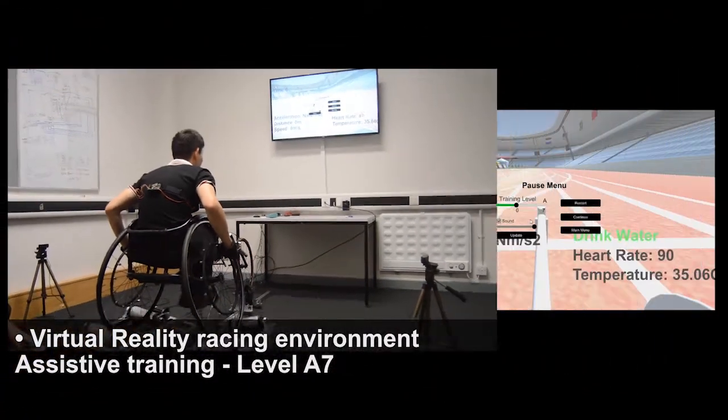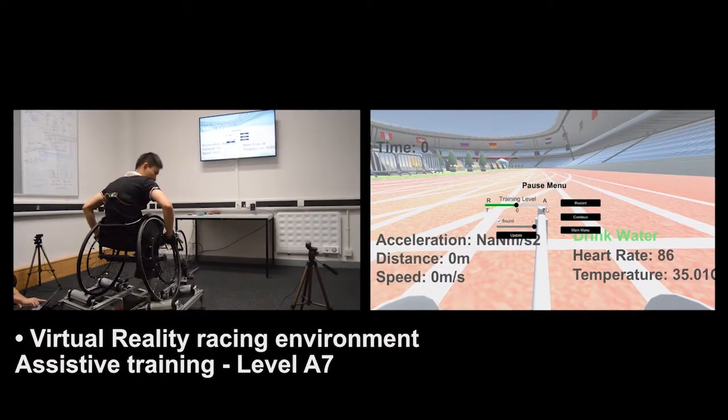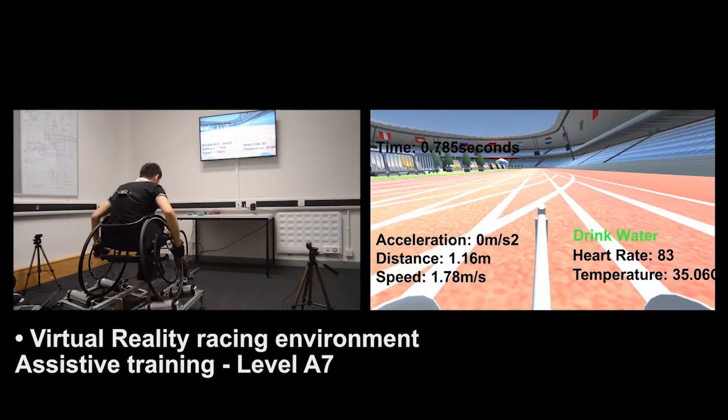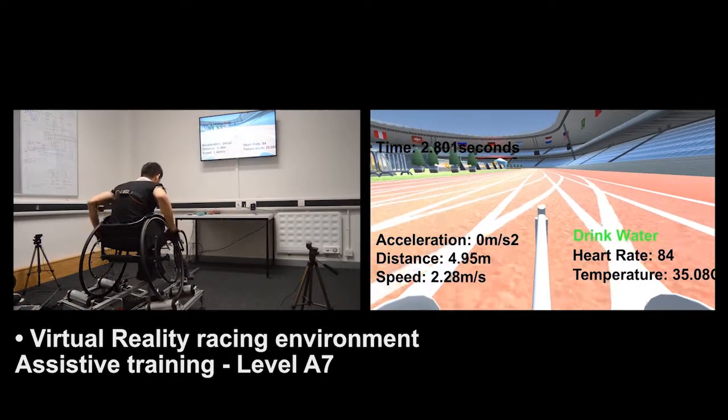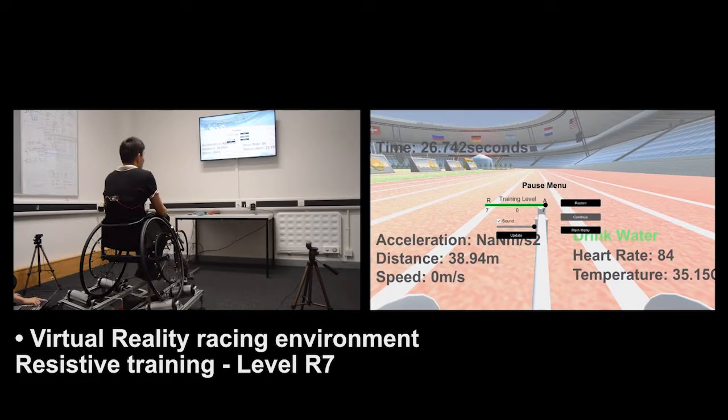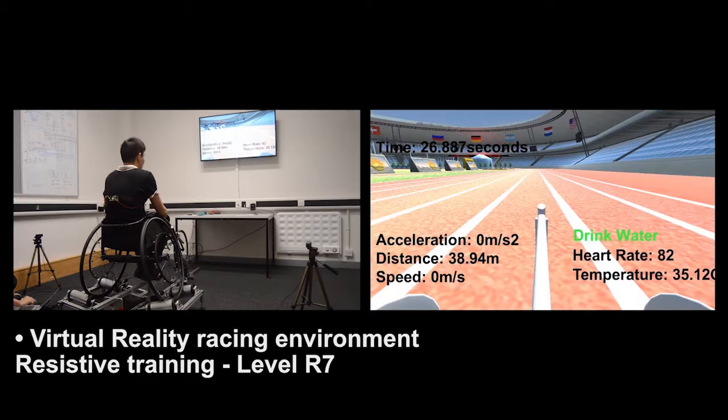In order for the athlete to perform training exercises, seven different levels of assistive training can be selected from the user interface, making it easier for the athlete to turn the wheel at a higher assistive level. On top of that, seven different levels of resistive training can also be selected for strength training.